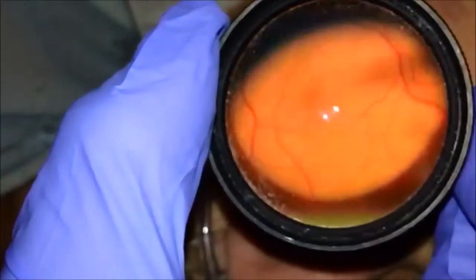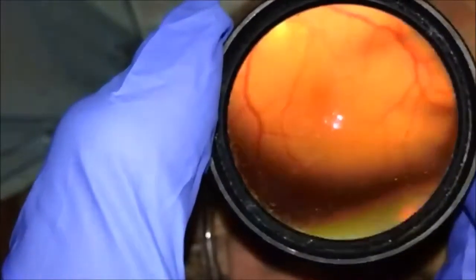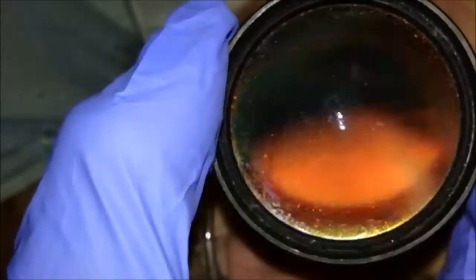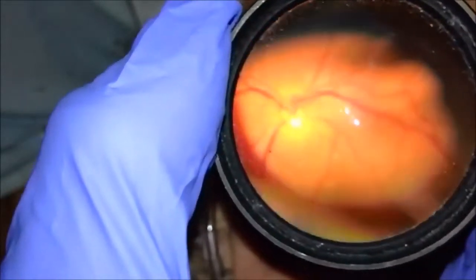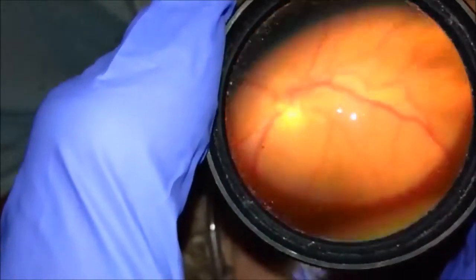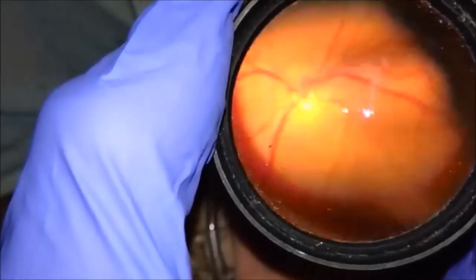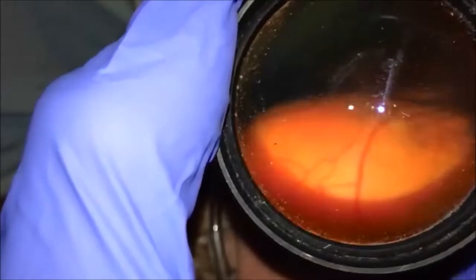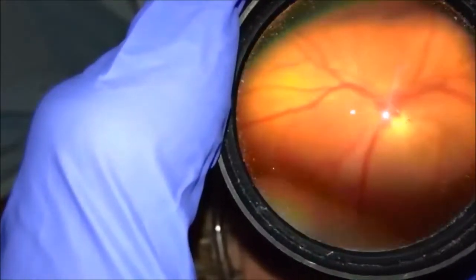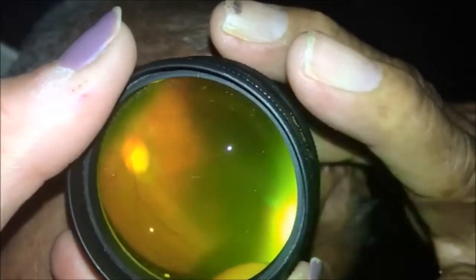To obtain retinal images, a patient should be fully dilated and lying in the supine position. The smartphone should be in video feature with its flash on. Holding the non-contact indirect lens in the dominant hand, the observer should then position the phone about 23 to 25 centimeters away from the eye using the non-dominant hand. The phone's flashlight should be parallel to the lens, and the exact position of the lens with respect to the eye will vary depending on its power.